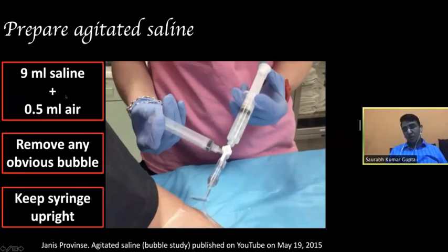Although some of the literature says that you can add blood and it improves the echogenicity, I personally feel that it increases the steps, it increases the requirement of absolute asepsis, and then there is a risk of contamination to the patient. So I would suggest 9 ml of saline and 0.2 to 0.5 ml of air. And on almost all occasions, I have never been pushed to use blood in addition to this.